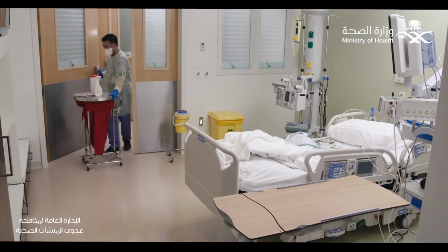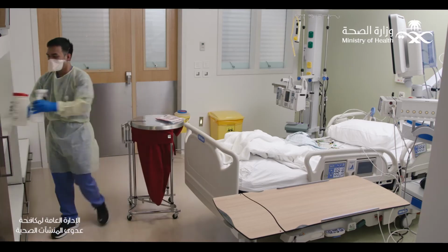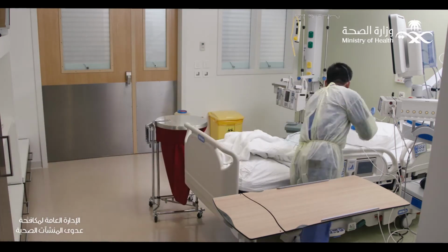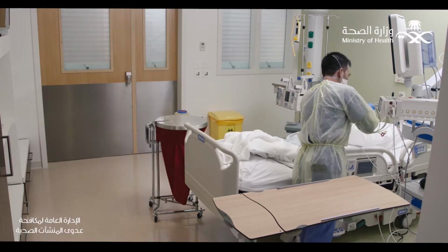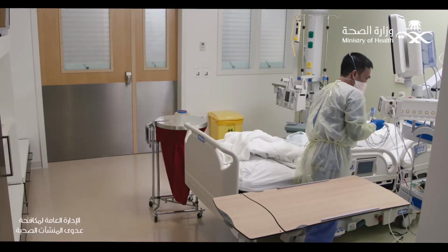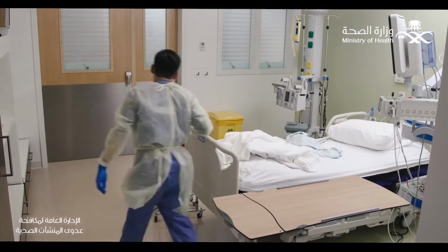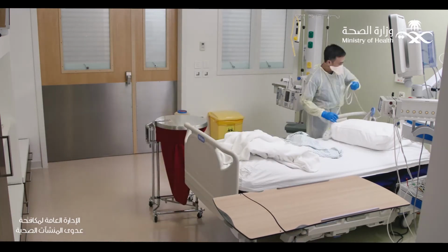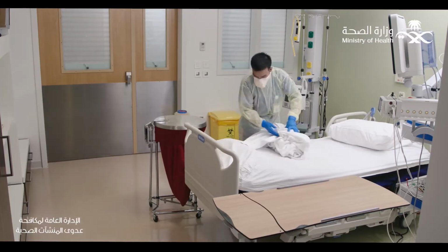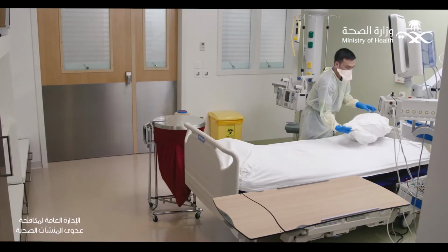Then the healthcare provider enters the room with his disinfectants and surface disinfectant wipes and starts removing all the existing wires and connections that connect the devices to the patient's bed, respectively. And he begins to remove the patient's belongings immediately, in order not to cause the dispersal of microbes in the atmosphere of the room and not to cause any scattering inside the room.